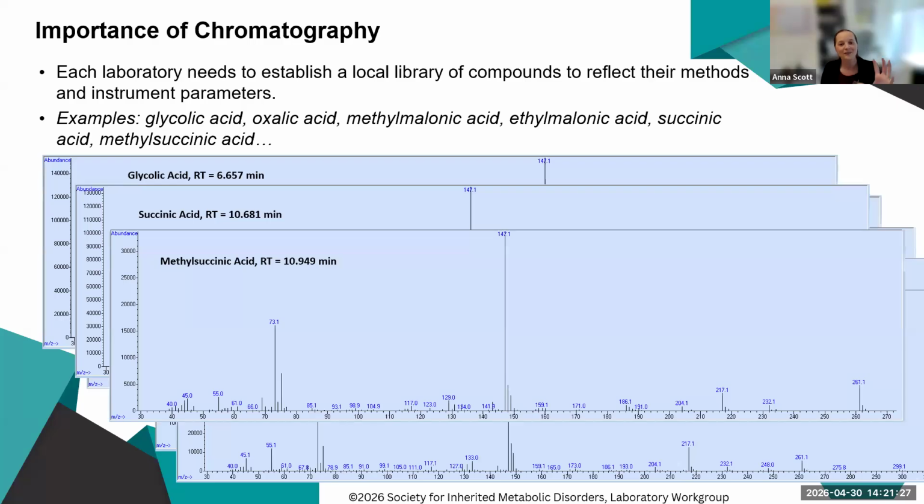So this is, again, not a comprehensive list, but I wanted to show you the similarities that can be hazardous when trying to identify a compound. And this is why the full picture, the masses, their relative intensity, and the retention time, and the local expertise of your lab, their familiarity with these compounds, is really important for correct identification. It can make all the difference in the interpretation.